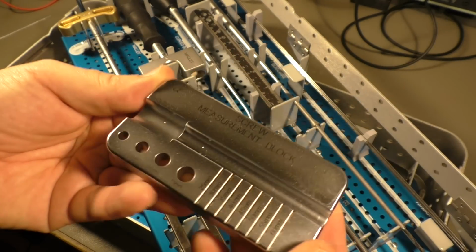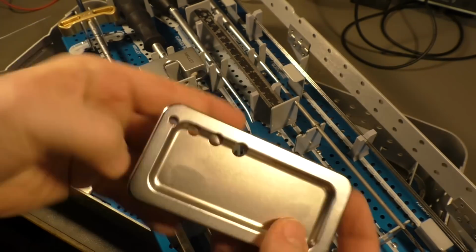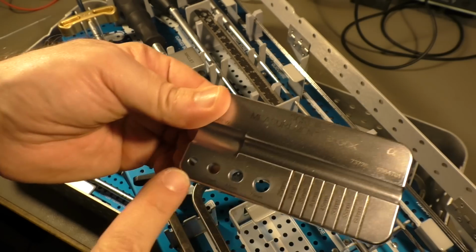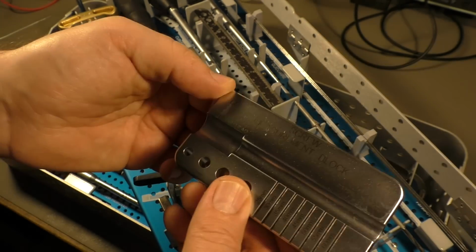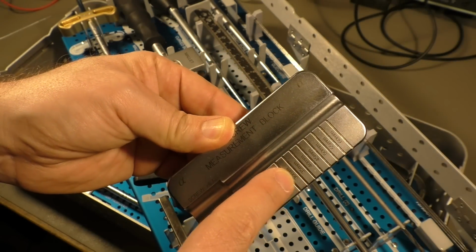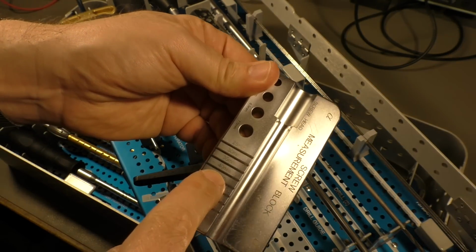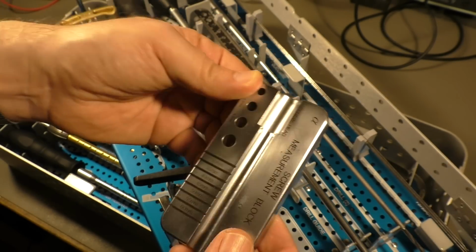Then we have a screw measurement block. That's a solid block of stainless steel with some holes to measure the diameter of the screws. And here you put in the screw and then you can read the length of the screw. So if you need a 40 millimeter screw, that would be this length here.